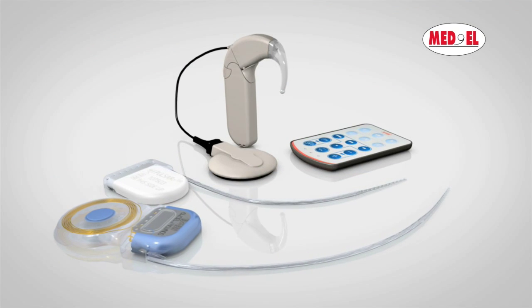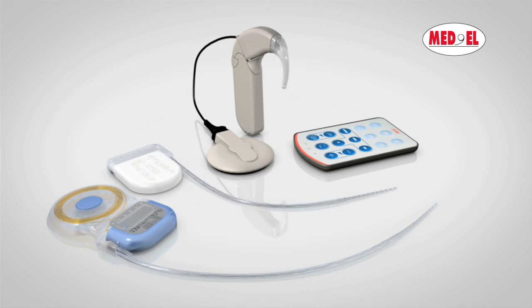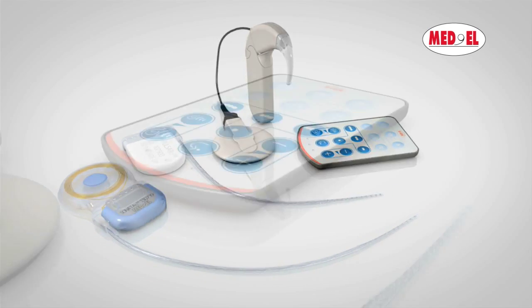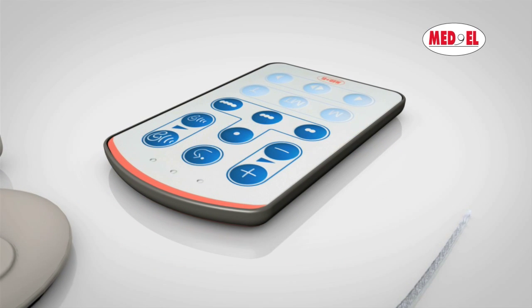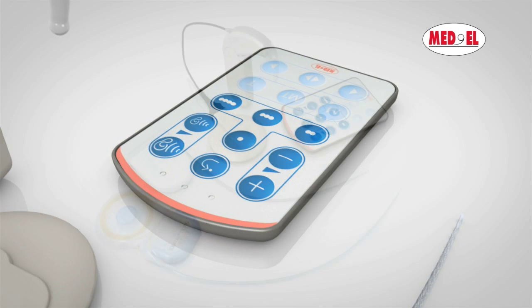The Maestro Cochlear Implant System takes advantage of the newest developments in both hardware and software technology, and is designed to be easy to use for both children and adults. The fine-tuner remote control unit allows users to make setting or volume changes easily and comfortably, without the need to remove the processor from the ear.